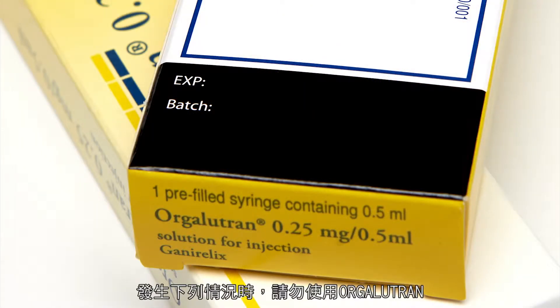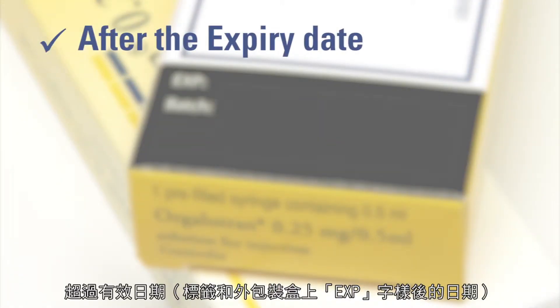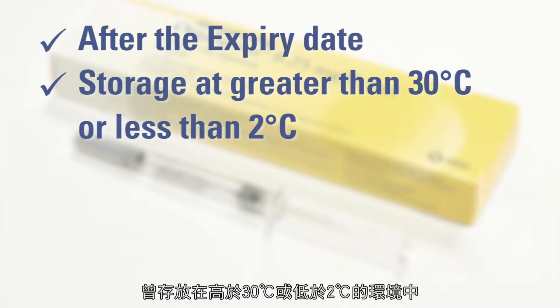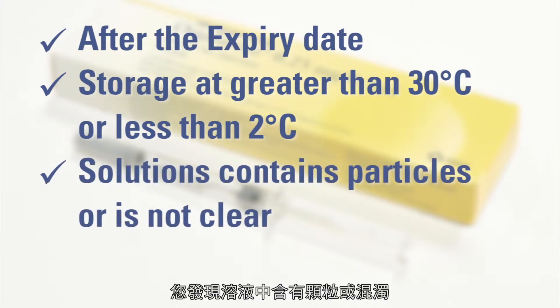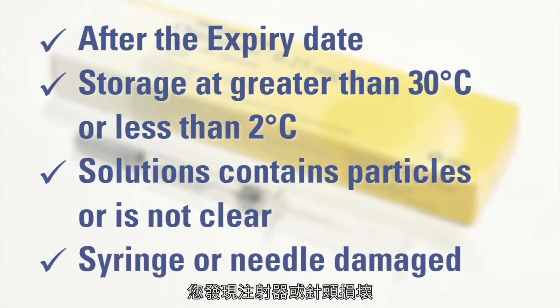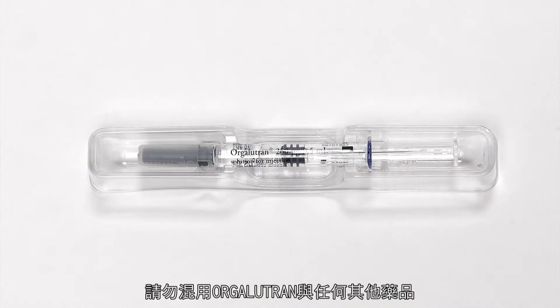Do not use Orgolutron in the following situations: after the expiry date, which is stated on the label and outer carton after EXP — the expiry date refers to the last day of the indicated month — if it has been stored at a temperature greater than 30°C or less than 2°C, if you notice that the solution contains particles or is not clear, if you notice that the syringe or the needle is damaged. Do not mix Orgolutron with any other medicines.